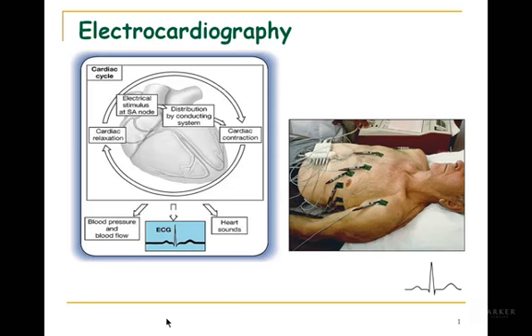This webinar is going to discuss the normal EKG, otherwise known as the normal ECG. EKG and ECG are synonymous. The ECG is the English acronym for electrocardiography. EKG is the Dutch acronym. Often they use the term EKG because the first person to record the ECG on a human was a Dutch physiologist. So out of deference to his contribution to the field, often people use the term EKG.